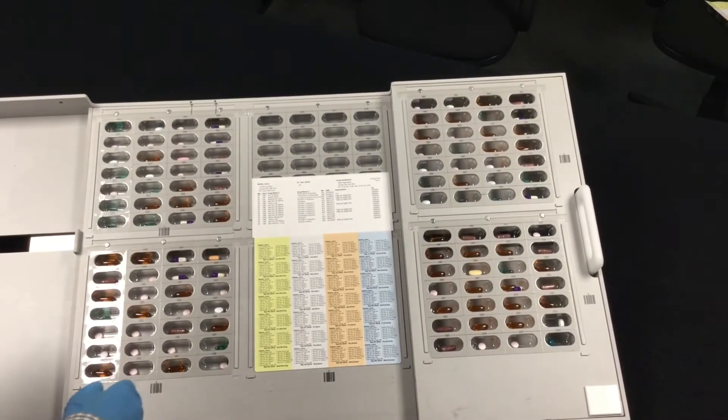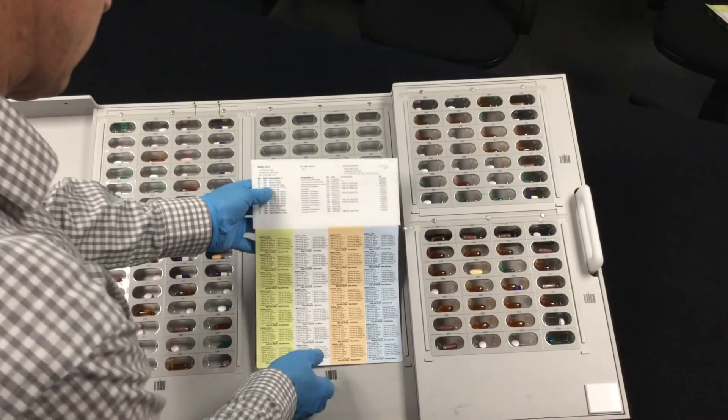To remove the package from the tray, grasp the top edge of the label and gently lift from the tray.